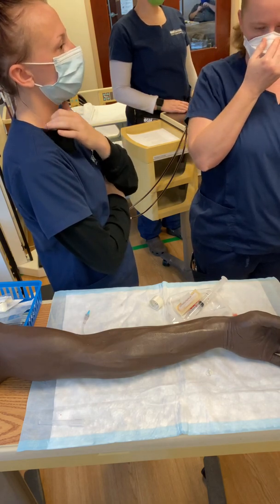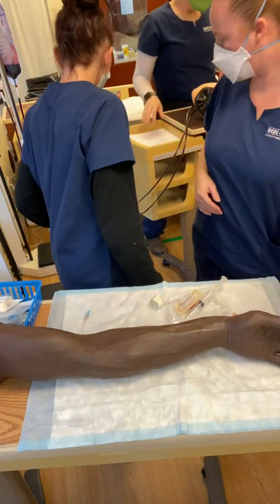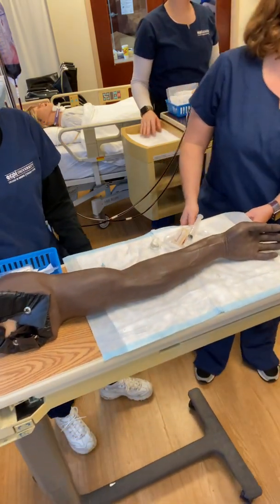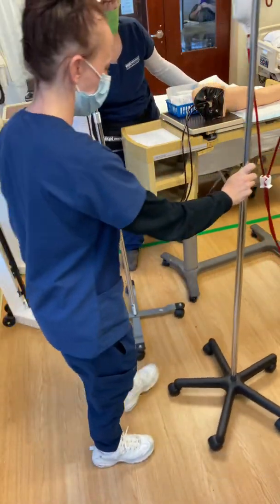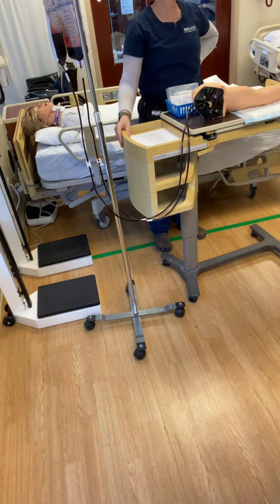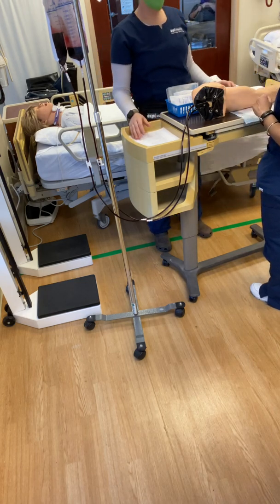Like, you go to the ER, if you put in less than an 18, that's a sin. Like, what are you doing? Because when they come to the ER, they go through a lot of procedures. They have a CT scan, they have this, and you have to have these bigger needles for this medication that we have to rush in. Especially if they're getting blood. That blood will infuse in the 22, but it'll be really slow, so we don't want to do that.